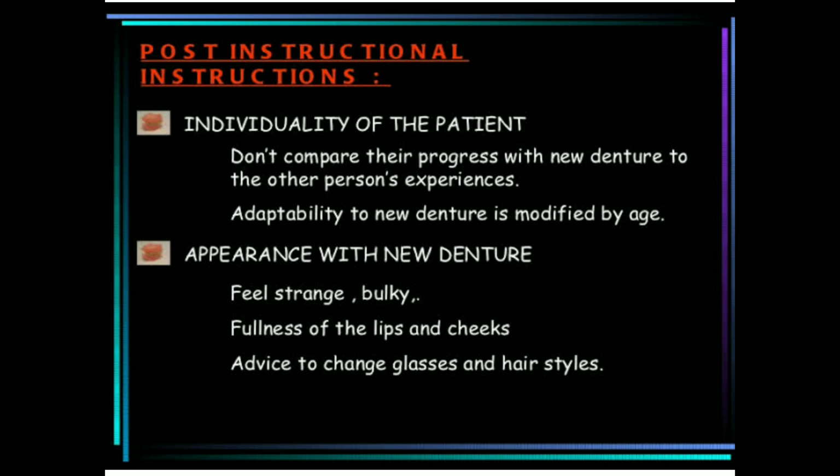So tell the patient that there will be some discomfort, and they can feel fullness of the cheeks because there are no teeth. However well you do it, it's new and it's a completely foreign particle which they are going to place in their mouth. So all the difficulties should be explained by the dentist and ask the patient to follow them, right?